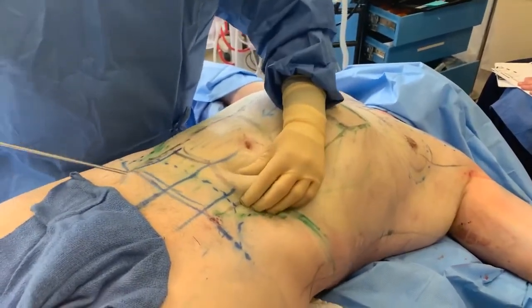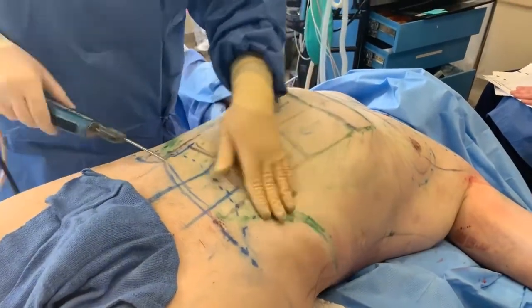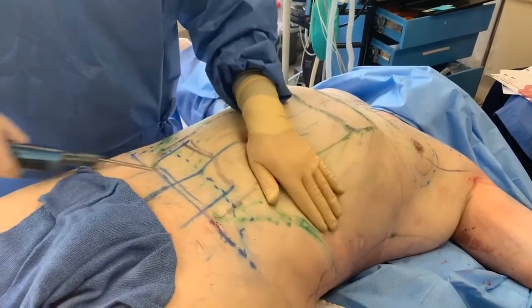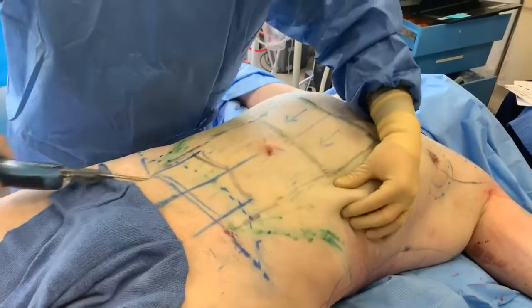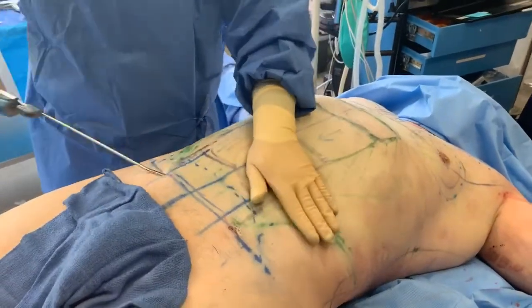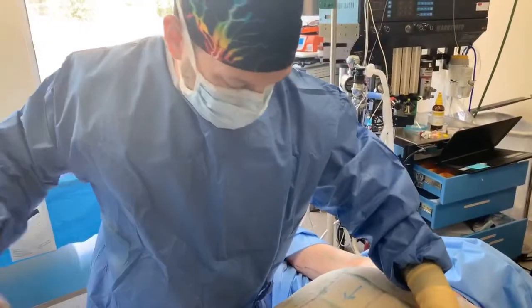Otherwise, you won't be able to see any of his results. We're doing this power-assisted device to help remove the fat gently. All that fat is going to be harvested and used for his chest and his biceps and potentially even more for his buttock.